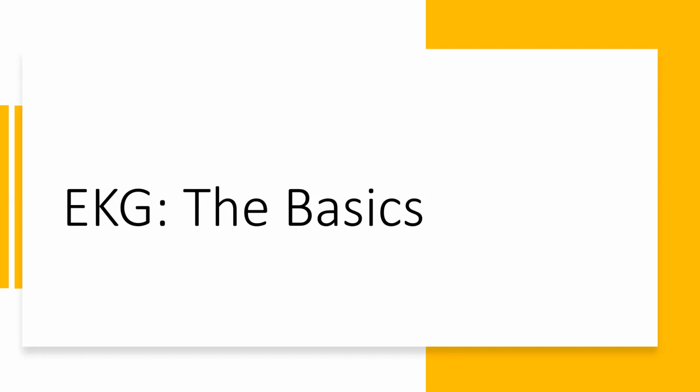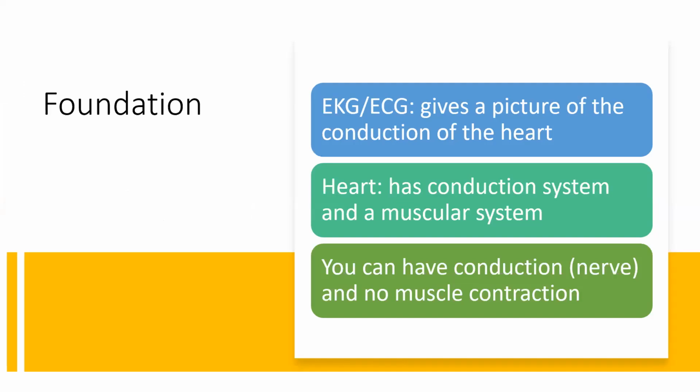The biggest thing as it relates to nursing school and your future licensure boards, like the NCLEX exam that you take at the end of all of this, is that it is all about identifying life-threatening emergencies, which we are not going into in this video, okay? There will be a separate video for more advanced EKG practices, but being able to recognize when something is not right, and then the appropriate interventions, are always the biggest thing to know about it.